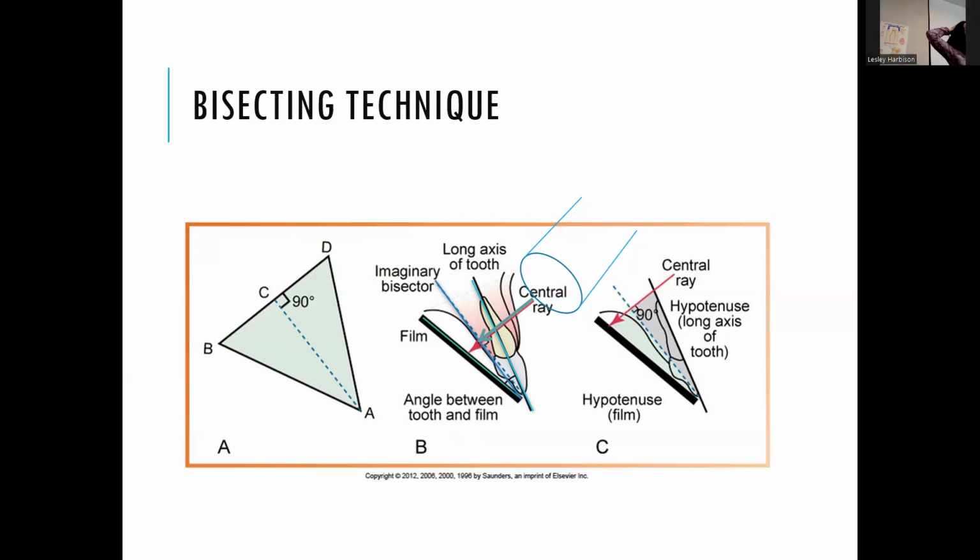Because Dexter's not a good patient to do a bisecting the angle on because he can't bite great and he has no arms to help you. And so we have to use rubber bands to get the snap array to stay. And there's kind of tricks to it. It's a little bit crazy, but it works out. I mean, you can see it demonstrated. It's just a little bit funny. I think the anterior is way easier to see on Dexter than the posterior. The posterior is harder.